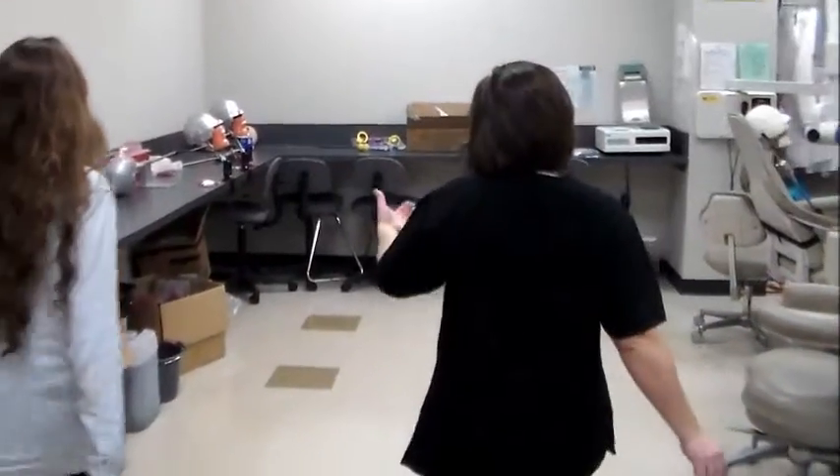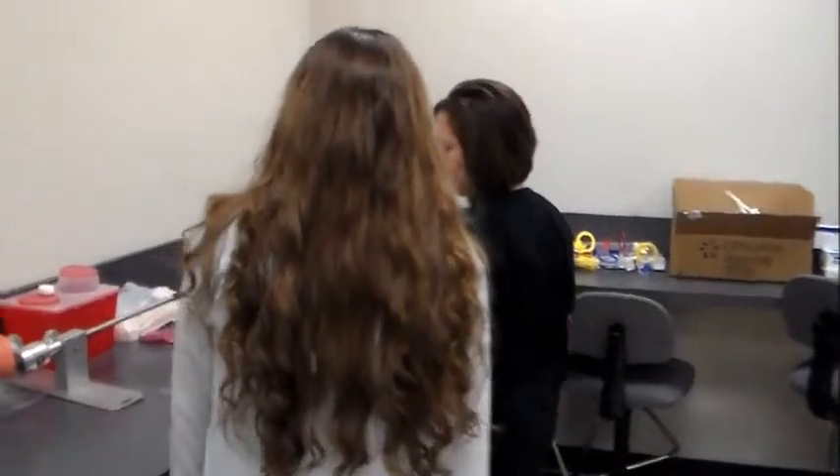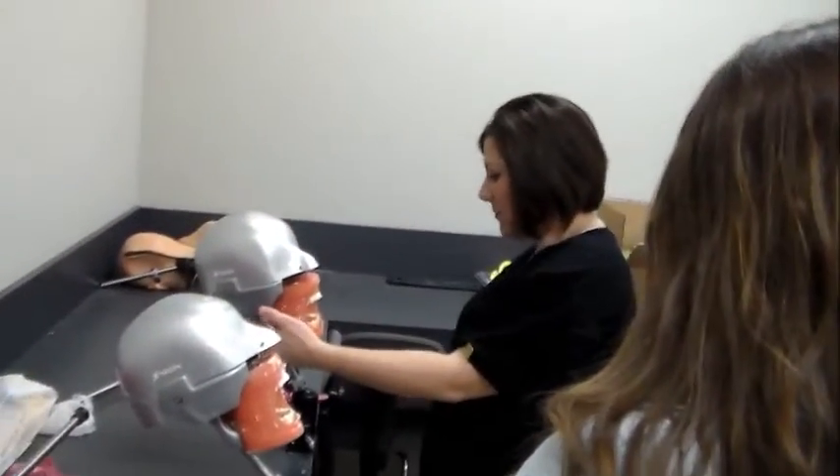Down here, we take molds of their teeth. Once we get really into how these are practicing and clean them, once they get really good with this, then we actually start practicing on each other.